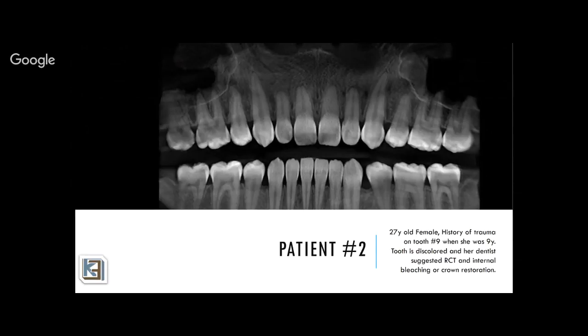Now, to treat a tooth like this with moderate to severe, this is actually severe calcification. When we clinically go in as endodontists, drill through to try to get a canal like this, sometimes it can take us anywhere from half an hour to an hour, sometimes 2 visits, until we're able to locate this canal and treat it properly. At that point, I had my Moonray, and I was printing Endo Access Guides, and I tried to utilize that for her in that case.